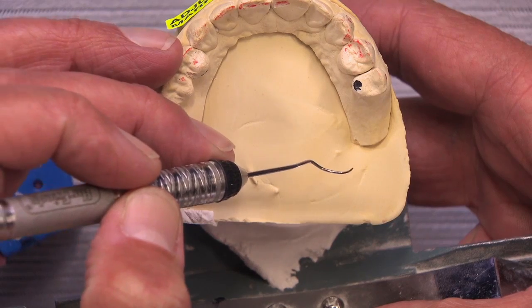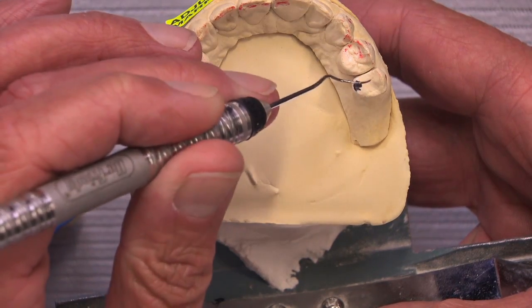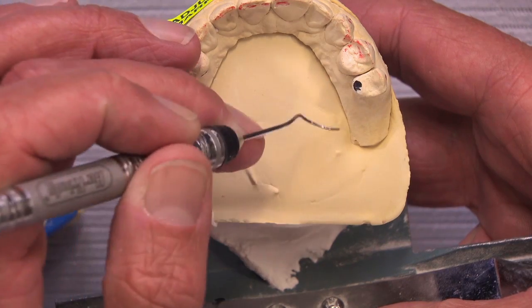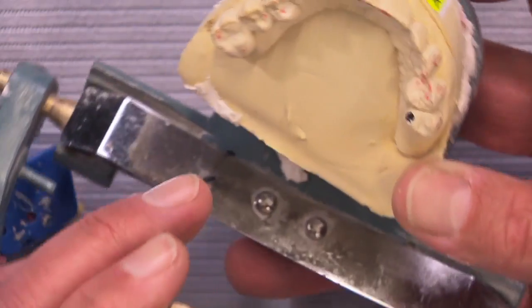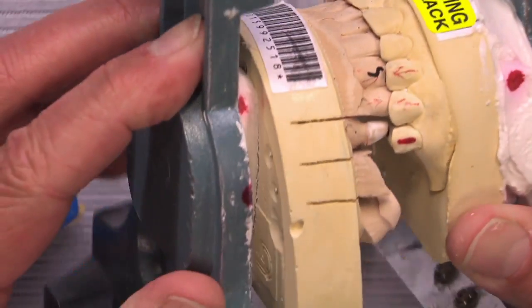You could use a fine grit diamond like a red stripe. You could even use something out of the BruxZir adjustment kit with the blue stripe on it, because that's a very fine diamond, and just hit it a few times and then it'd be very easy to polish afterwards. And of course, when you put the bridge in and had the patient bite together, you'd be able to identify with the articulating paper whether or not you had removed enough.